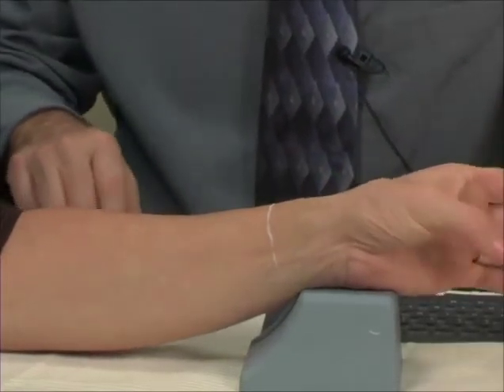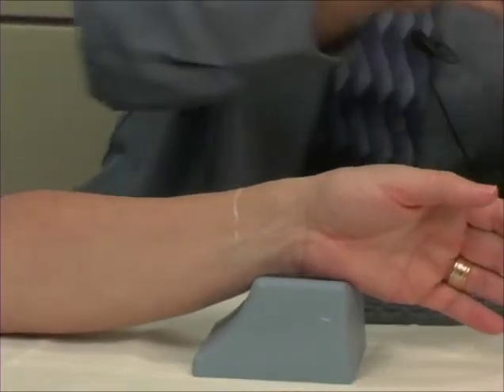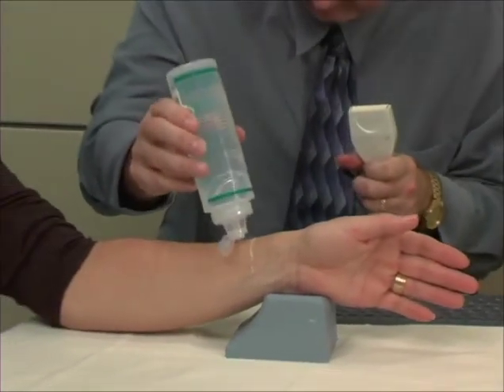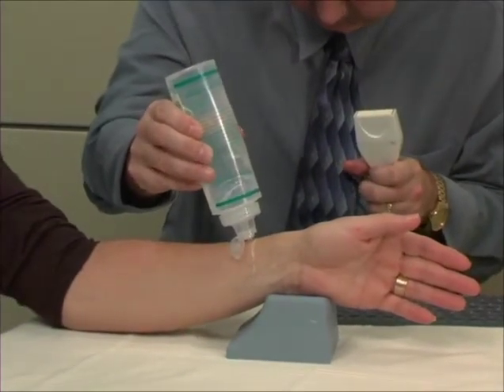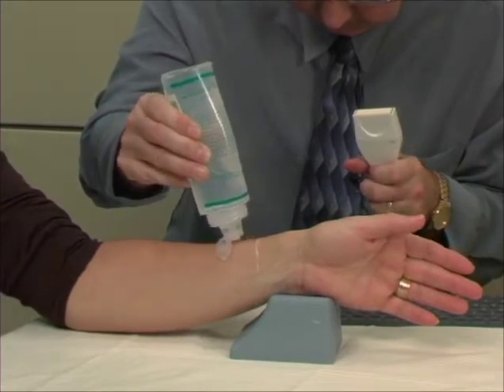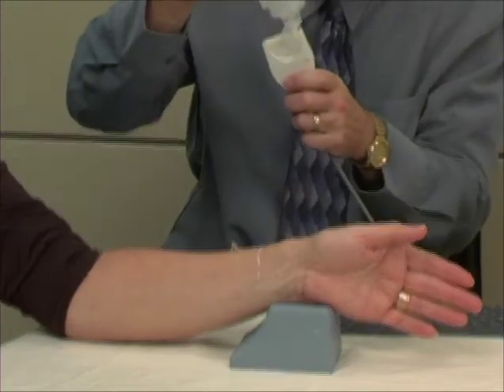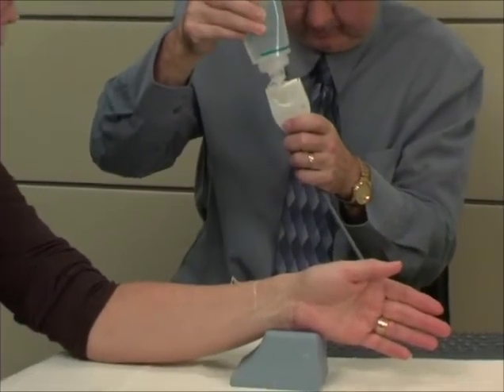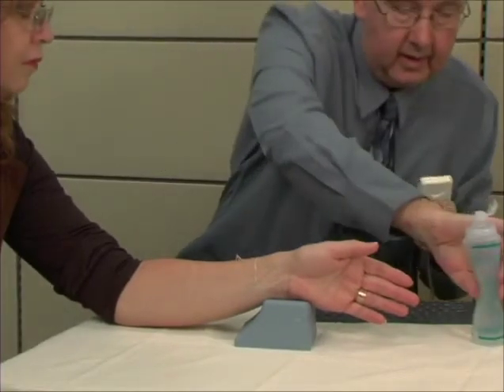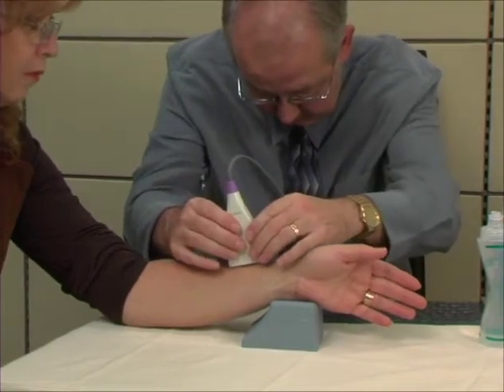There we go. Now the next thing I need to do is take some of the lubricant. It may be a little cool. I'm going to put a little bit on your forearm here. And I'm going to put some on the probe. And I'm going to basically just get the connection going first before I start the measurement.